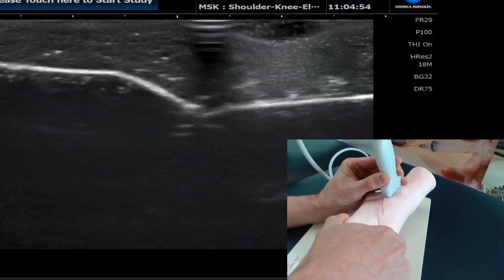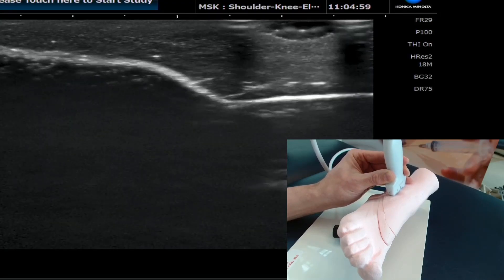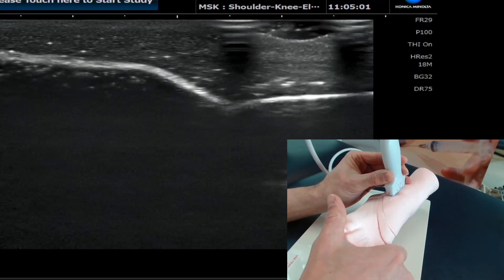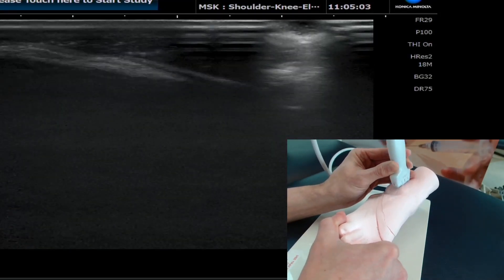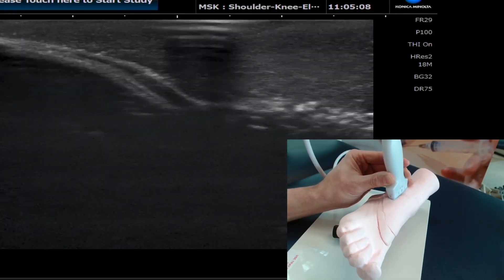We've got a really cool phantom here where we can change the angle of how we're doing this injection. I'm going to show you how having the foot on its side — or in reality, the patient in side-lying — would really help with positioning and getting access.